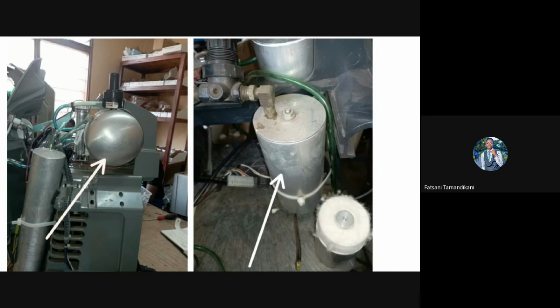So in the graphics, you can see a product tank. You have the product tank for the DeVilbiss 525, and on the right there's the product tank for an Airsafe concentrator. If you open this product tank, you find the zeolite. So this product tank is filled with zeolite, while the DeVilbiss one doesn't have zeolite inside.